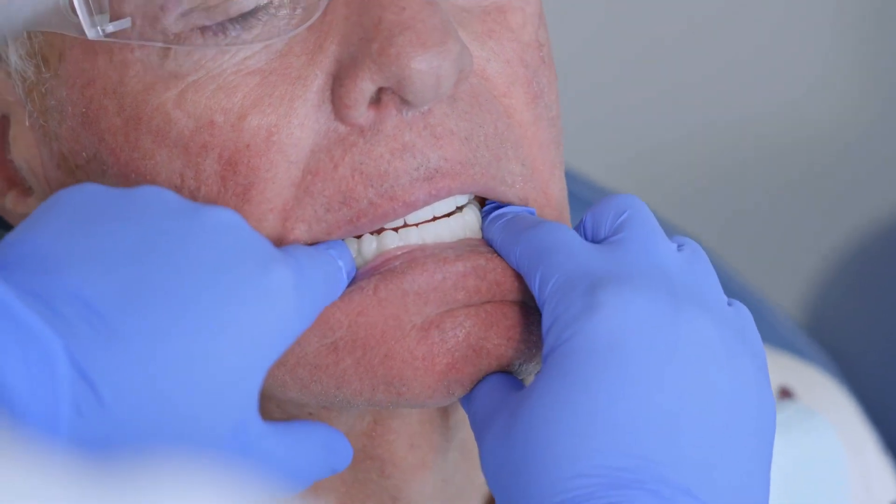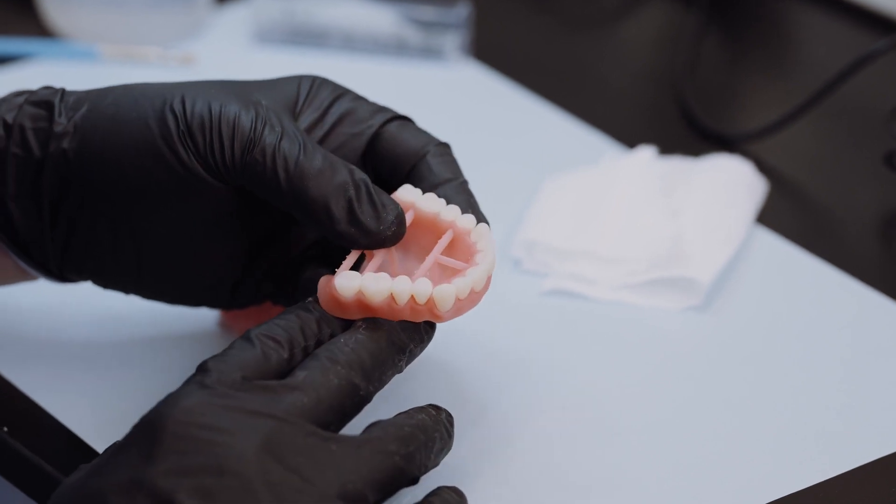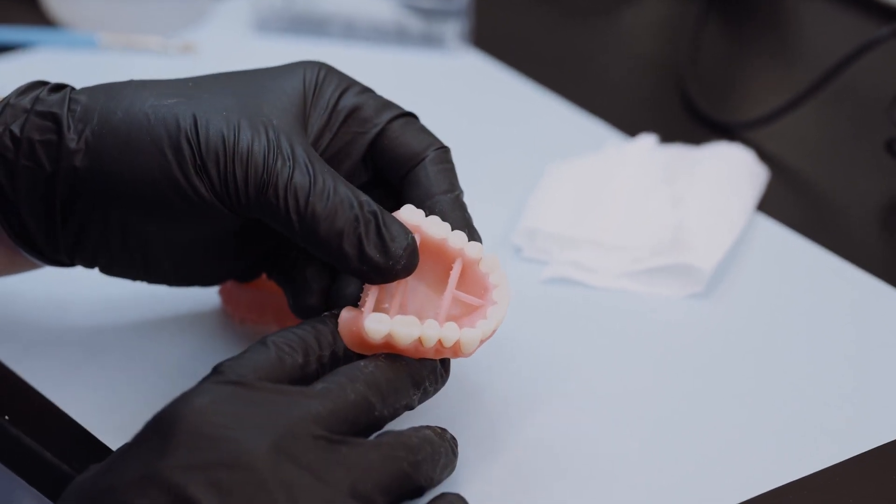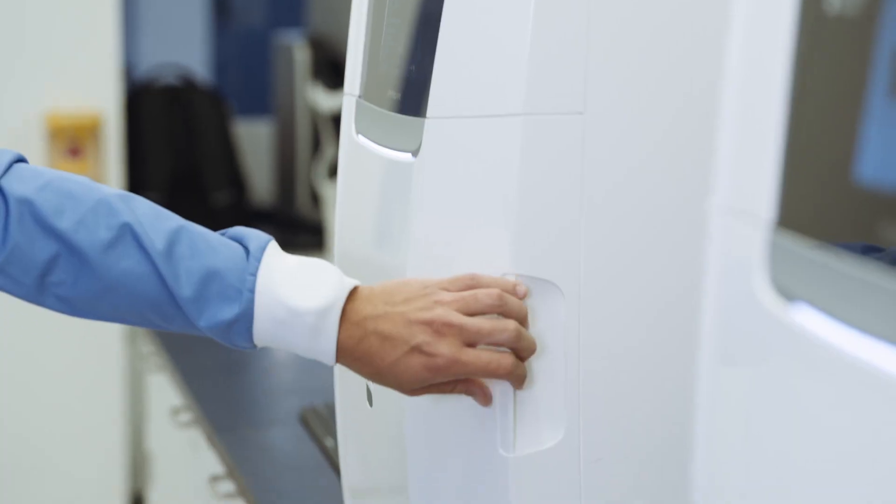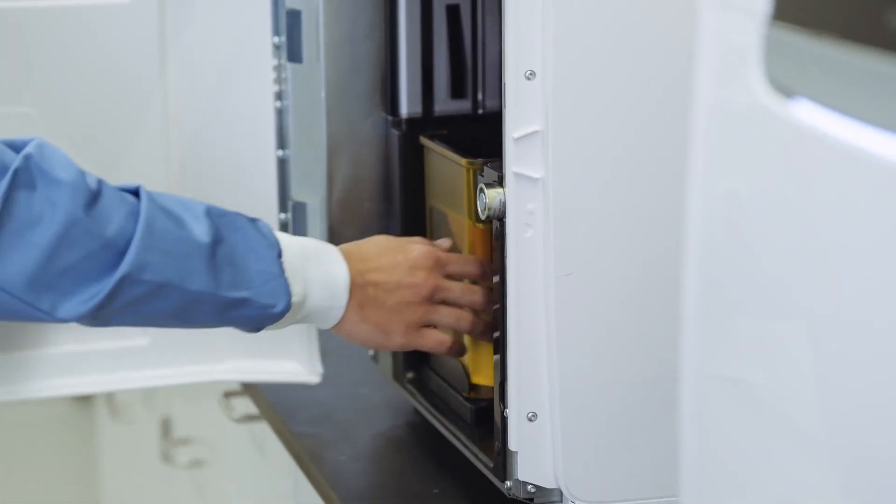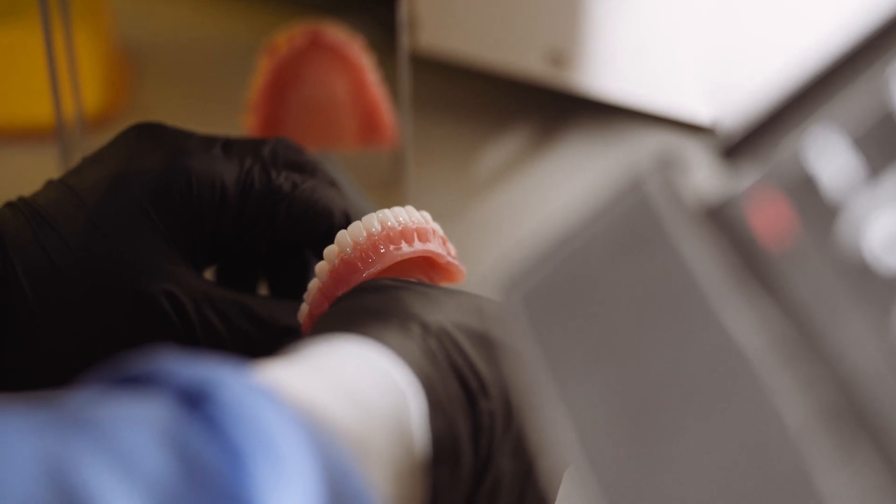The benefits of printed dentures to me is a better fit for the patients and more ease of use long term. If a patient has a problem, it's something that's very easy to replace. It's amazing that we can do it now, like just in a day we can have a denture printed.